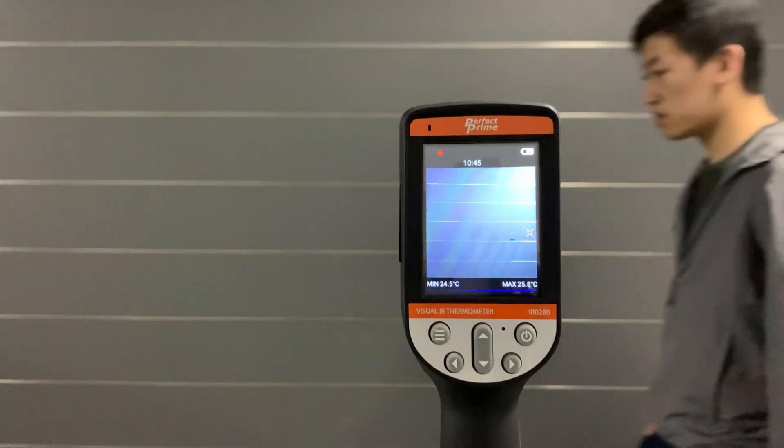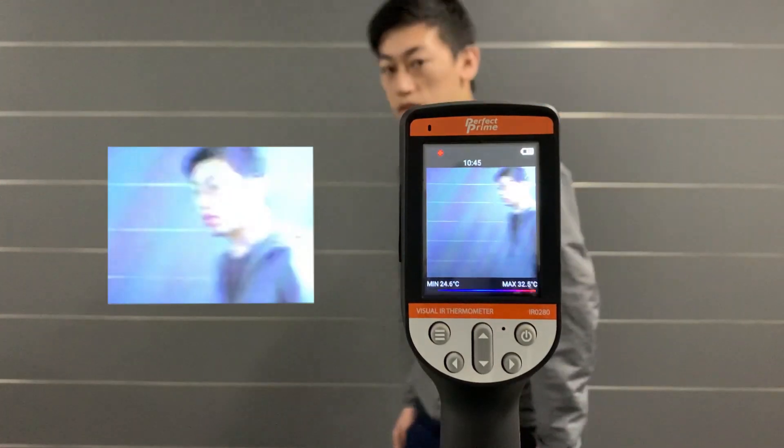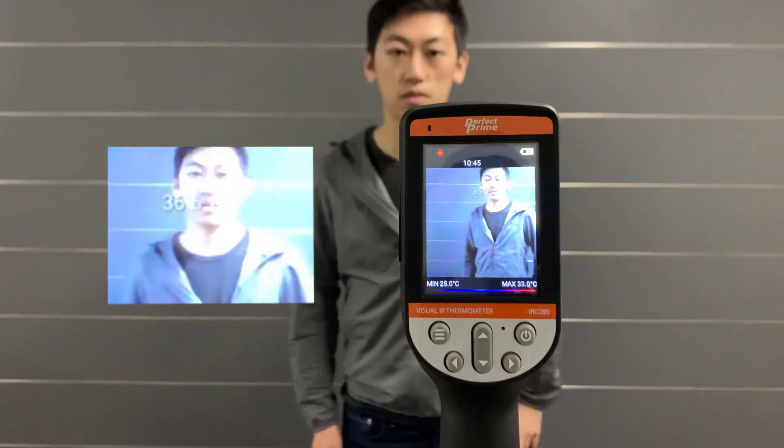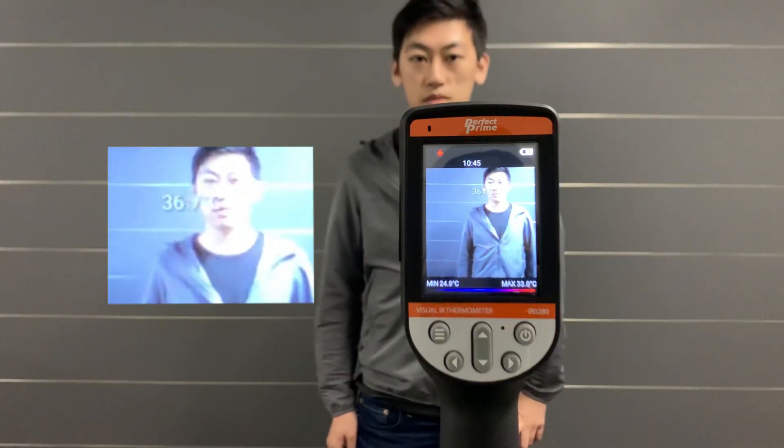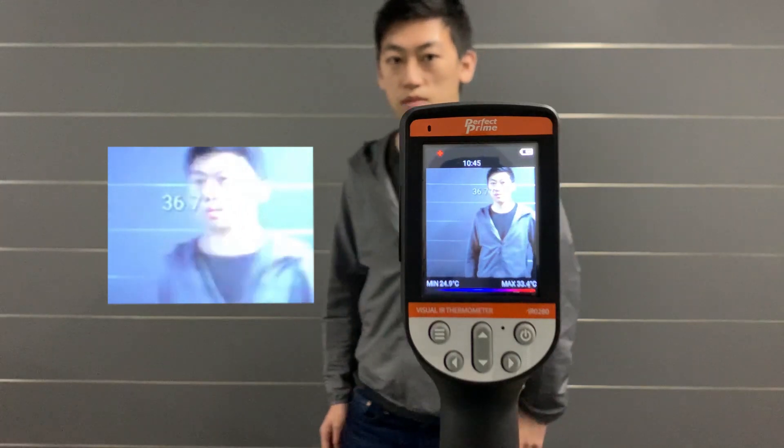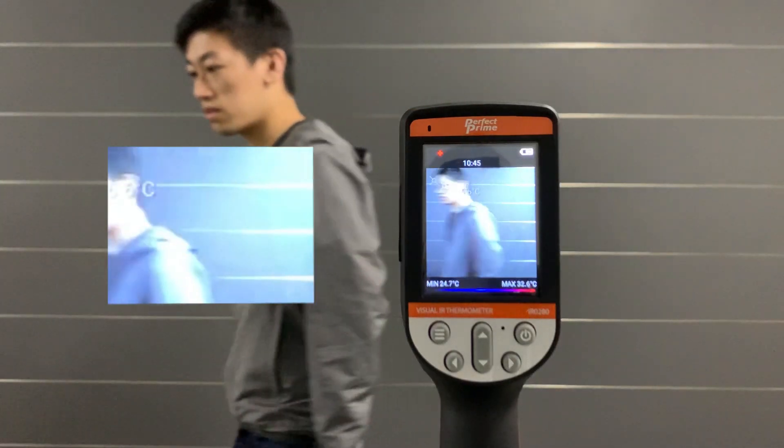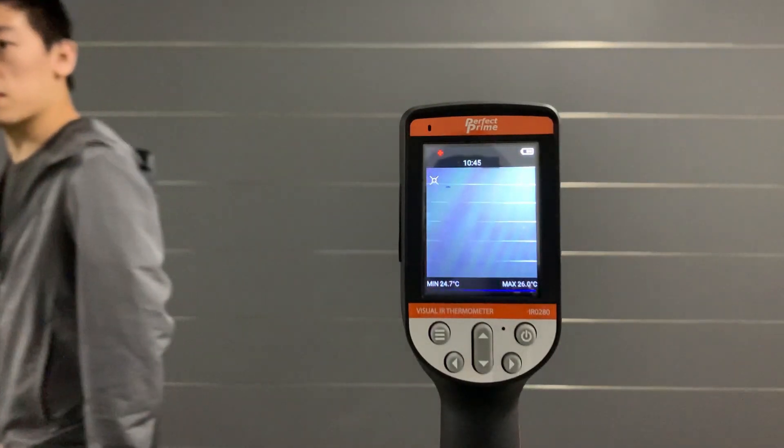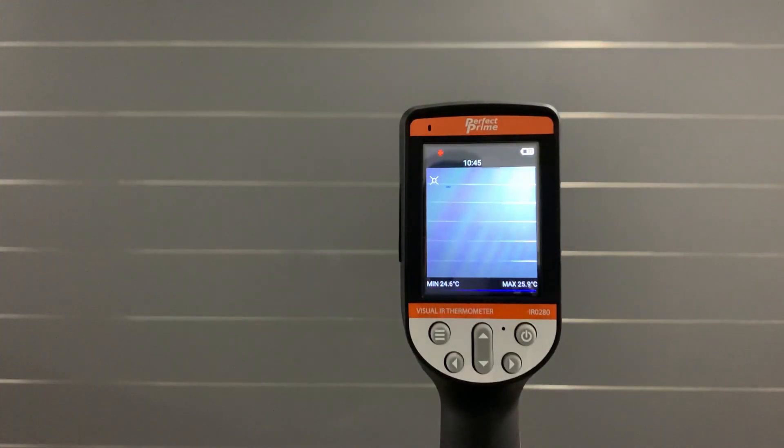Or with the follow detection mode, it will detect the highest temperature shown on the screen, which can also be very effective with the thermal camera pointing at the forehead.